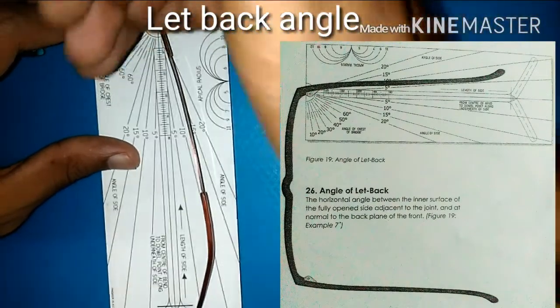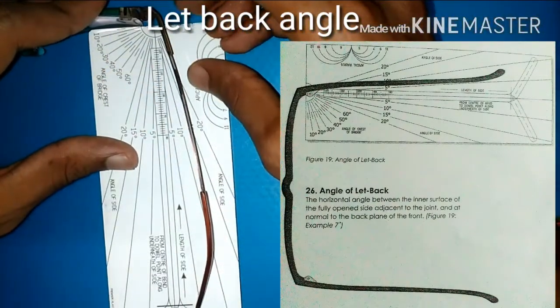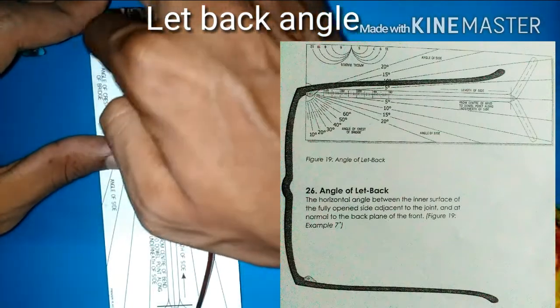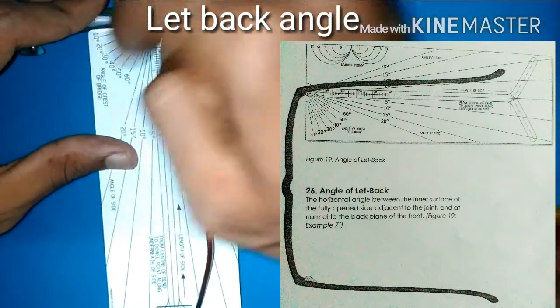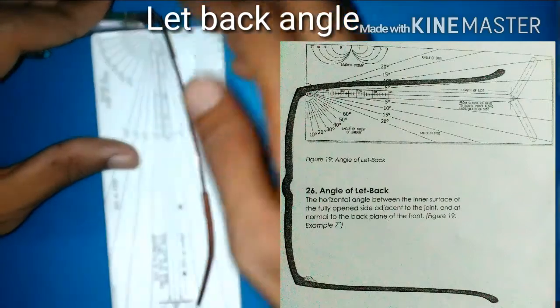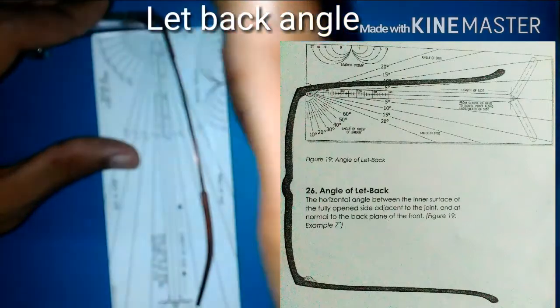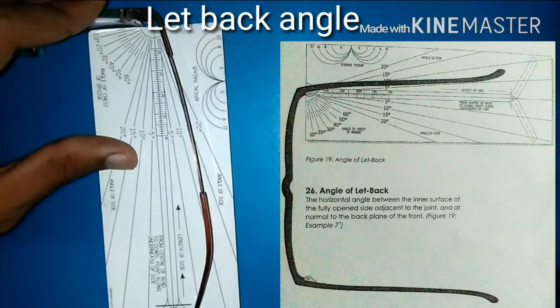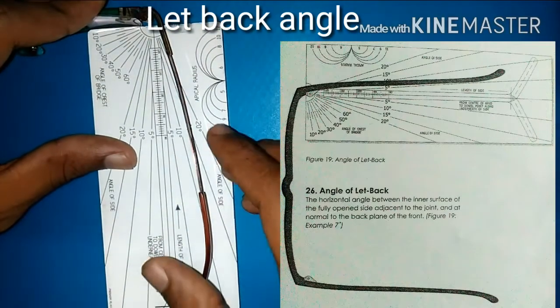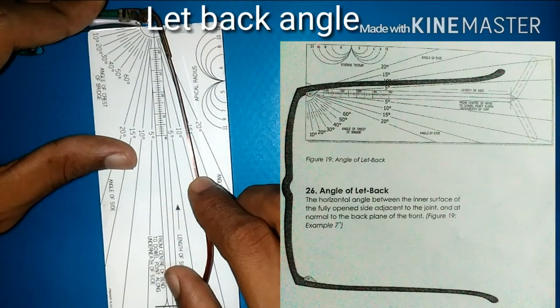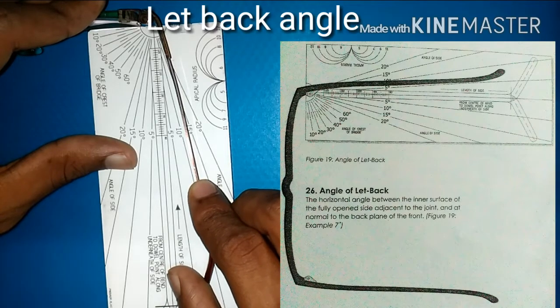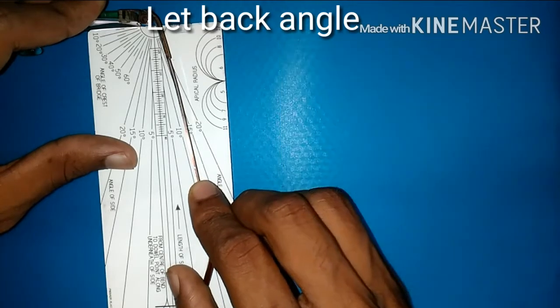The angle of let-back is the angle at which the temple bends back with respect to the inner surface. To measure that, place the inner surface of the front plane along the sides of the ruler and try to measure at what angle it inclines. For this frame it's around 10 degrees.